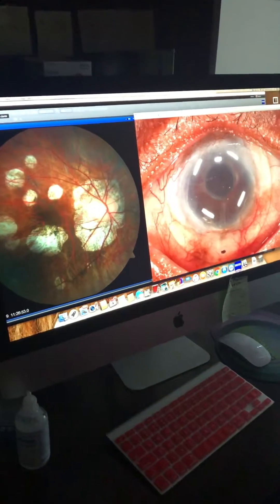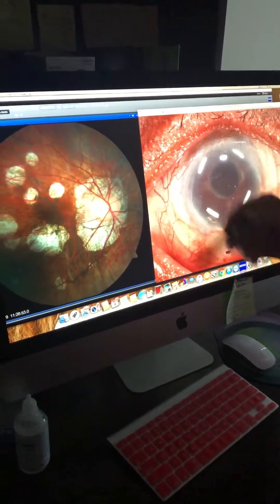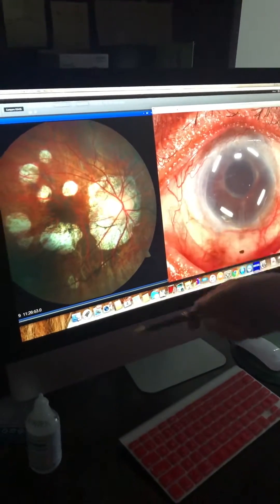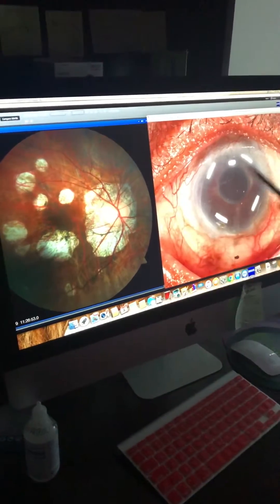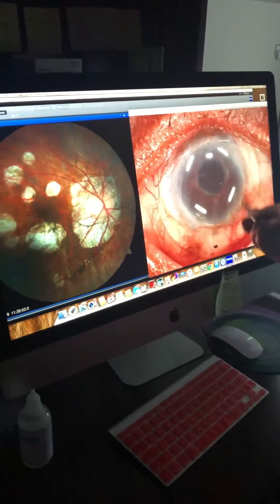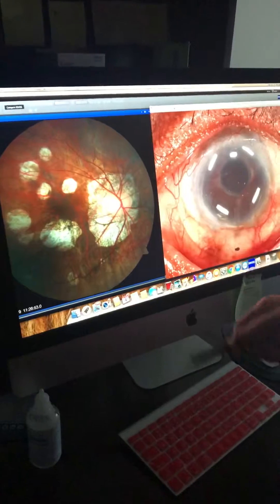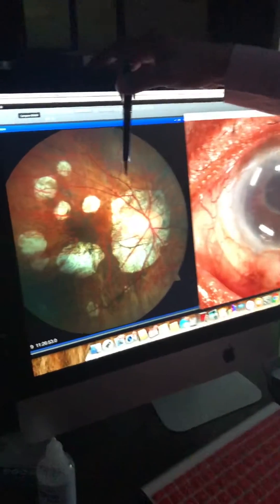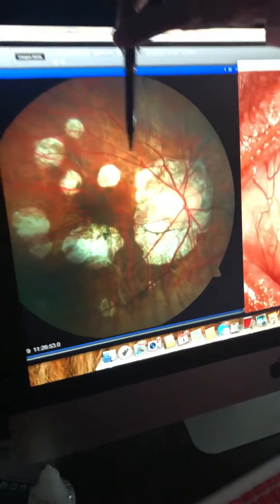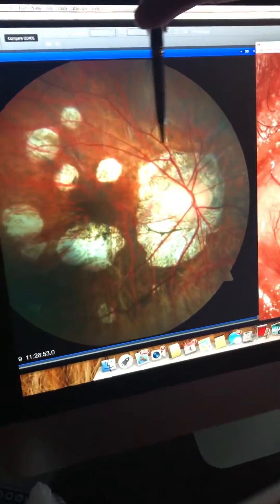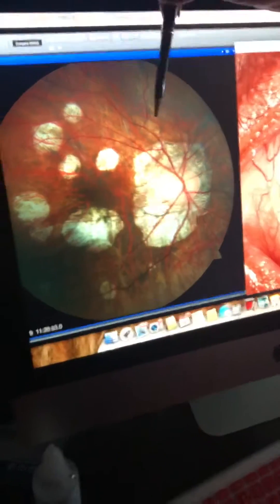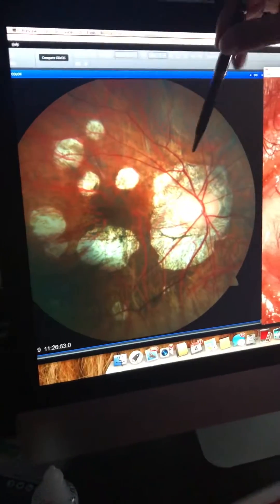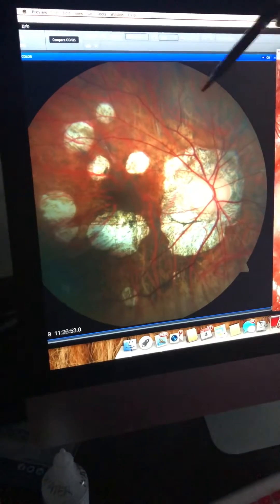Hi, I'm Dr. Boschnik and I just want to show you the right eye of two different patients who have significant, entirely different issues. The right eye I'm pointing to — this is the back of the eye, the retina, also known as the fundus, of a patient with a very high level of myopia.